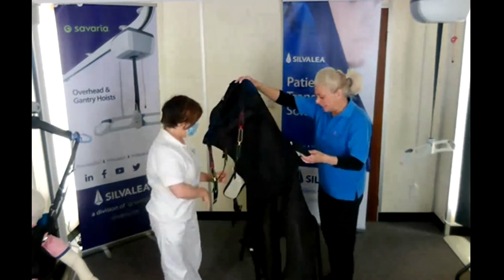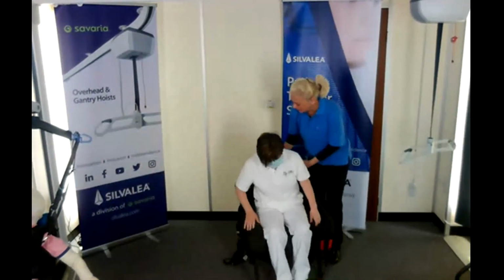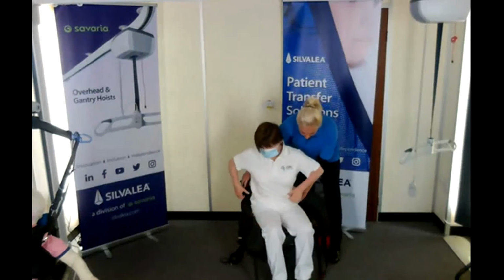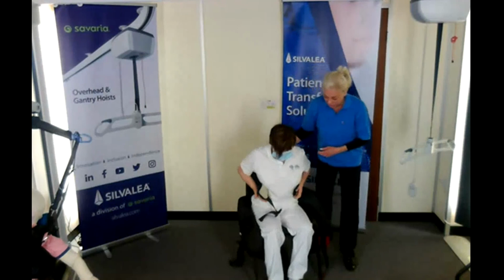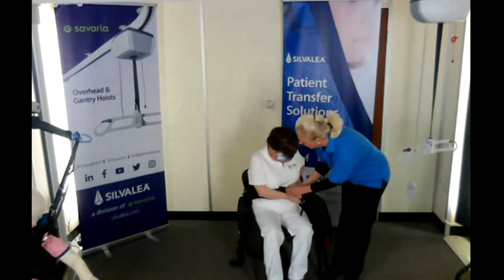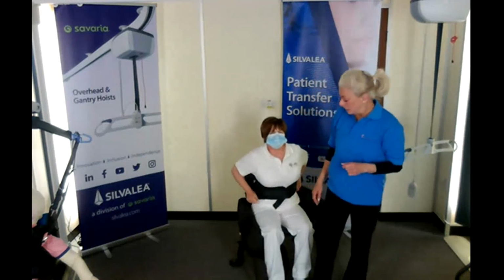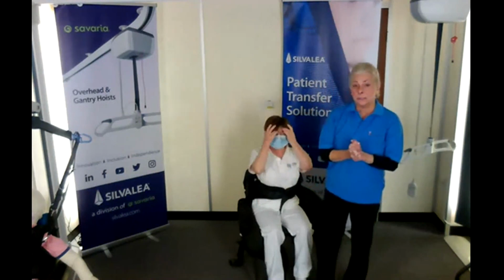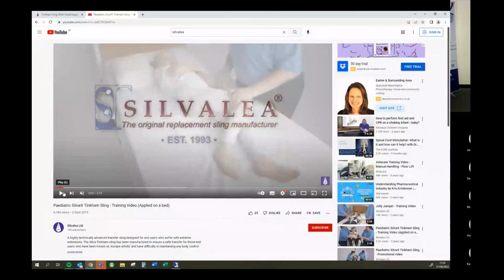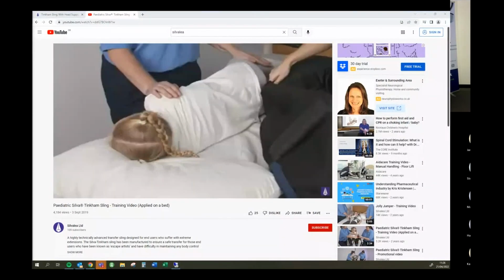It's better fitted on the bed. I think the first thing is to make sure you get the waist support in position. I think, Alice, have you got a little video that we can show of this one, because it is complicated and it is easier to see from the little clip of it being fitted on a bed. So it can be applied in a chair, of course, because it's a divided leg section, but by inserting it on the bed with someone on their side, it's much easier.